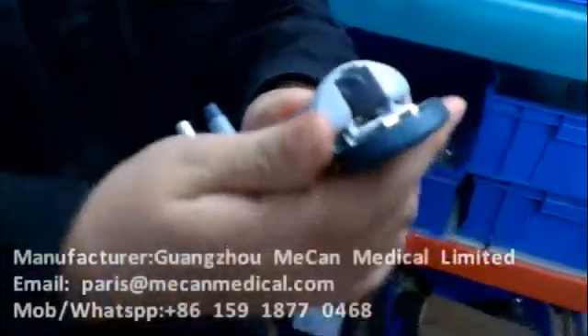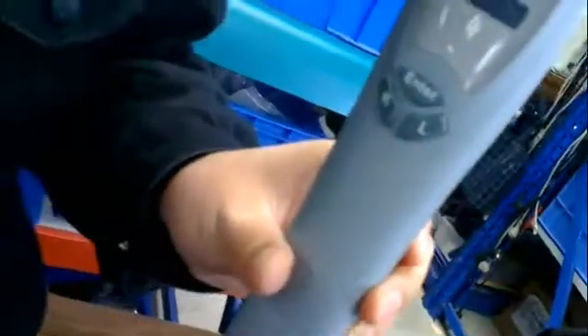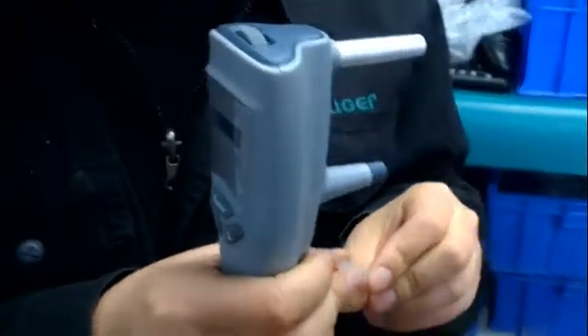Open the back cover. Taking the AA battery. Close it. Now we can insert the probe.